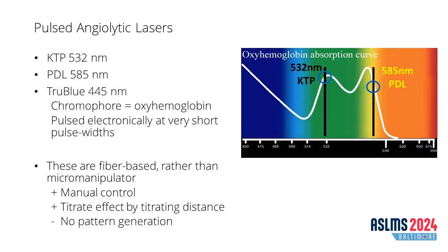But for many of us, myself and Dr. Snow included, we've really transitioned away from carbon dioxide lasers to the pulsed angiolytic lasers. And I think there are a number of reasons that we've done that. I'll mention that there are largely 3 angiolytic lasers in otolaryngologic practice at this point that are used for this fiber-based photothermolytic effect. KTP laser for a long time had been our workhorse laser at 532 nanometers.